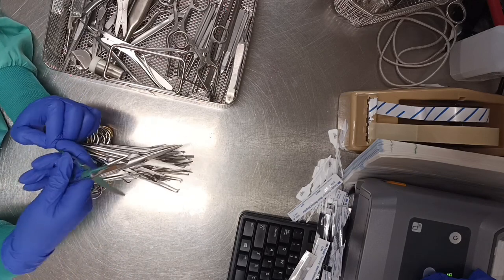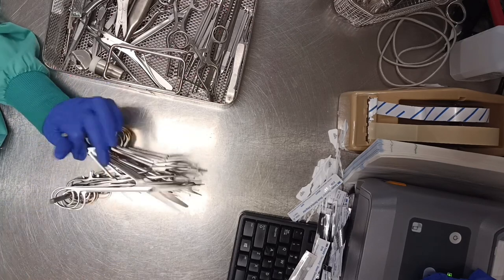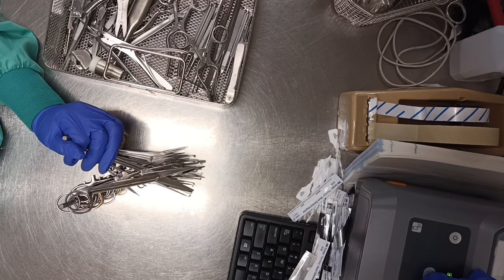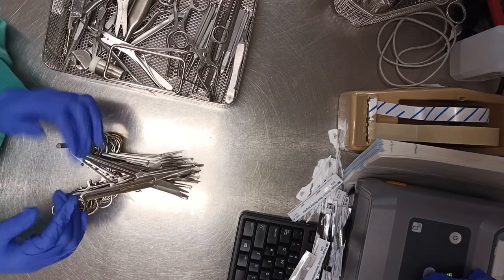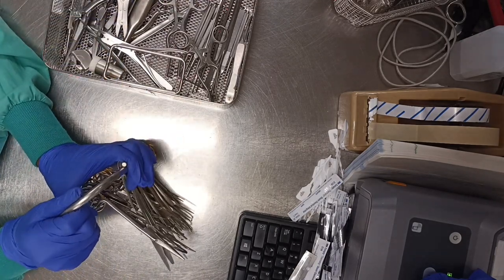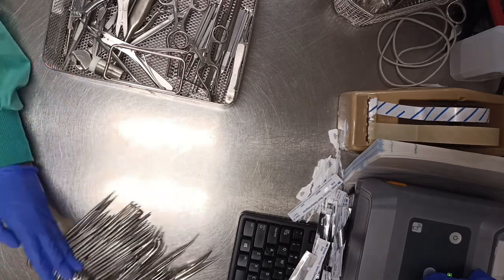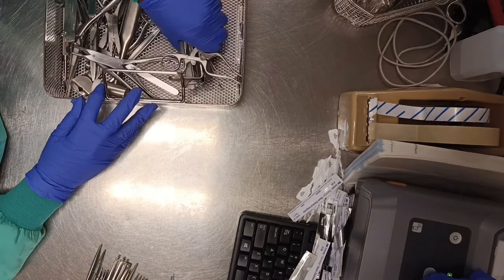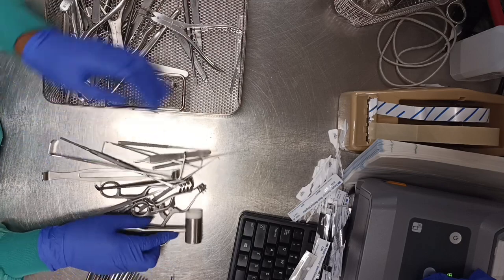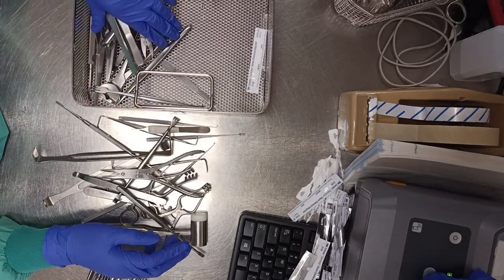Guys, I'm pretty sure we are almost done putting the instruments on the stringer. I'm guessing that should be the last one we had to put on the stringer, and then the next thing we'll probably do is get into assembling the retractors and all the other good stuff. So I'm just going to take them out and lay out my indicators.